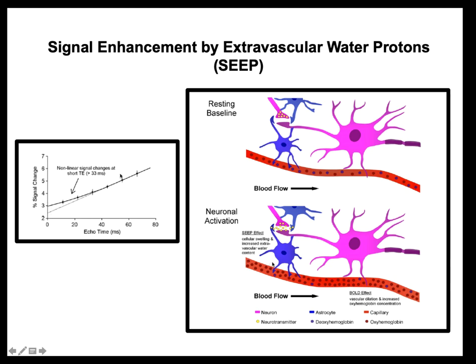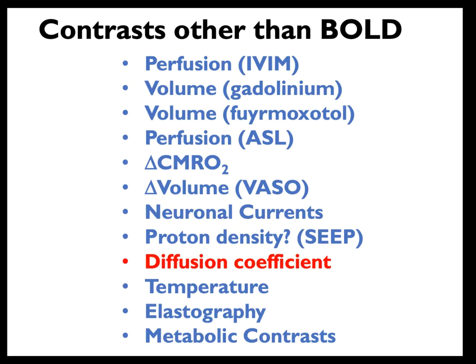I'm not sure I really believe that without more evidence, but once again, just for the sake of completeness, I figured I'd mention SEEP contrast. And it seems to work really well in spinal cord. But I haven't seen it much elsewhere.